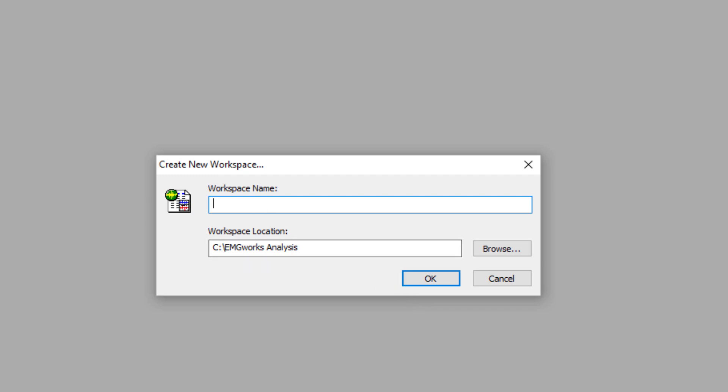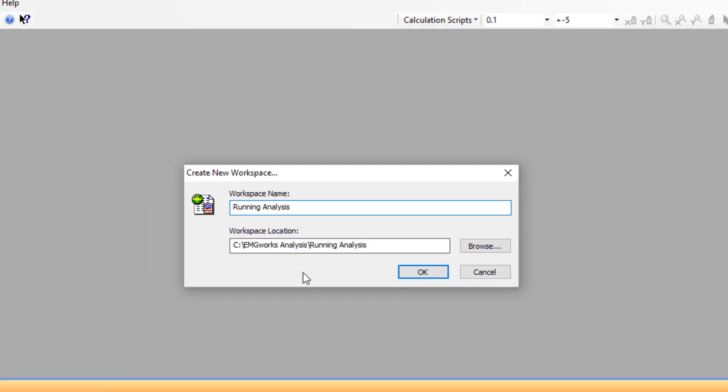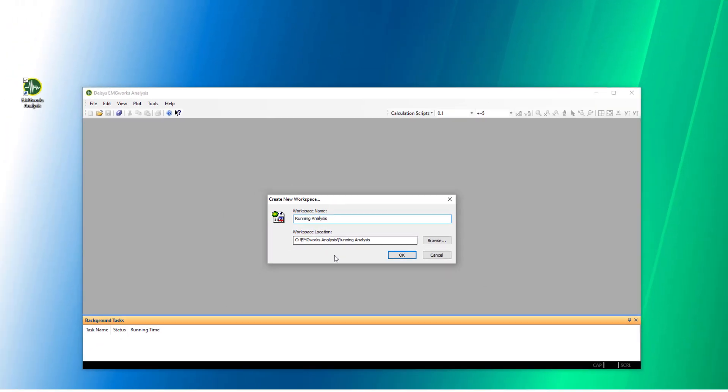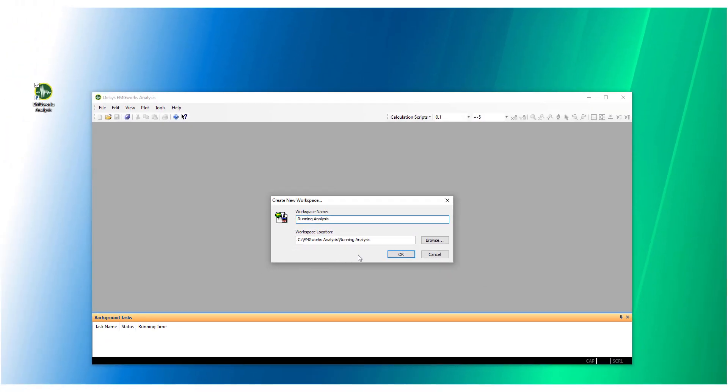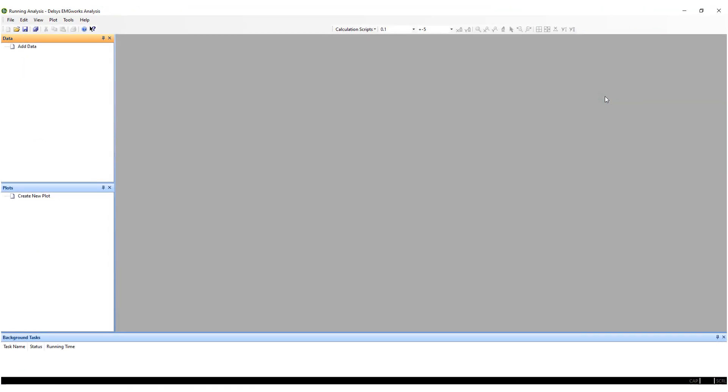Type an identifying name in the Workspace Name text field. This will automatically be appended to the Location text field, which specifies where the workspace will be saved. Click the OK button and the specified workspace will be created and displayed in the Program screen.